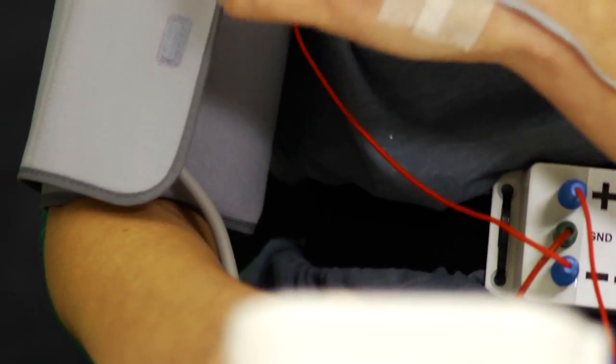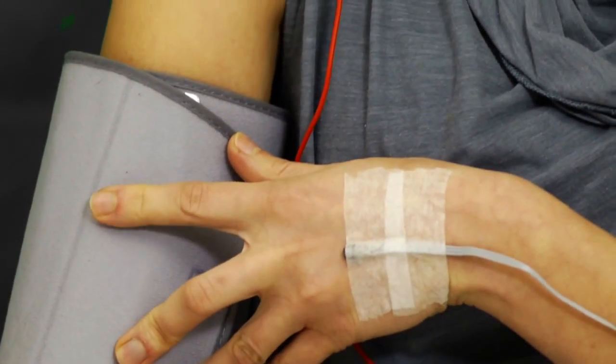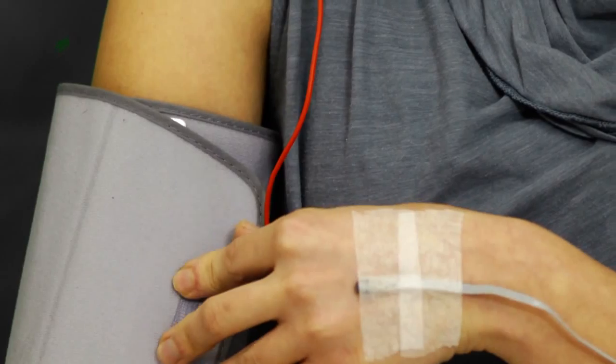Secondly, blood pressure. I've already placed the cuff on my right arm so that it doesn't interfere with the blood flow on my left arm, and the blood pressure is expected to rise a little bit.